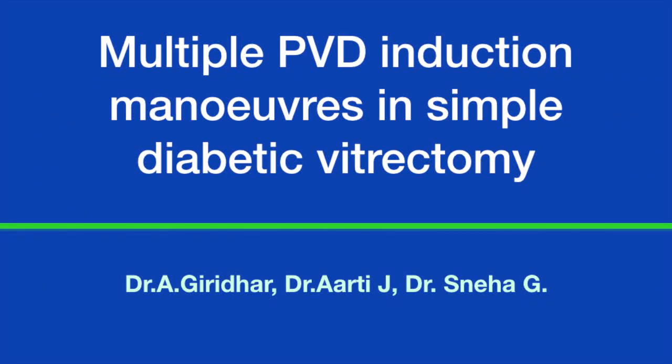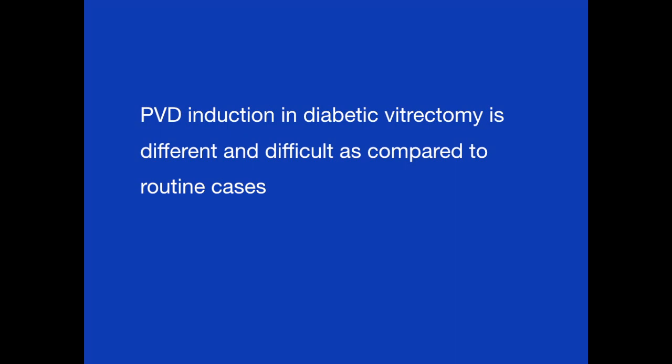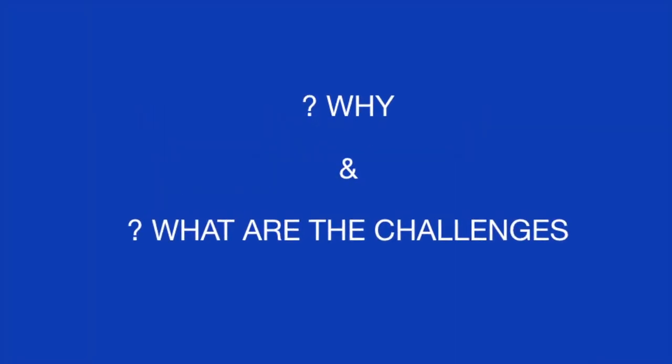Multiple PVD induction maneuvers in simple diabetic vitrectomy. PVD induction in diabetic vitrectomy is different and difficult as compared to routine cases. Why and what are the challenges?